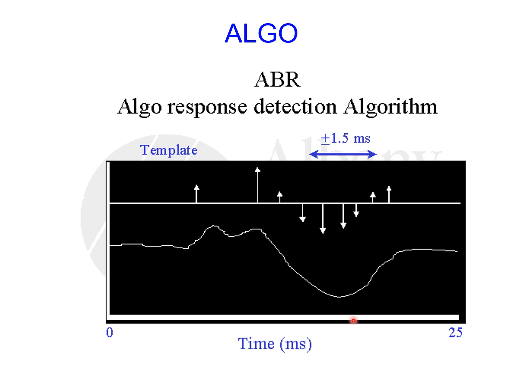Then in the actual recording, we would expect to see similar amplitude variations. Again, it's a cross correlation. If we get a good cross correlation between the recording and the template, then there's a response. On the other hand, if we get a poor cross correlation, then there's no response.